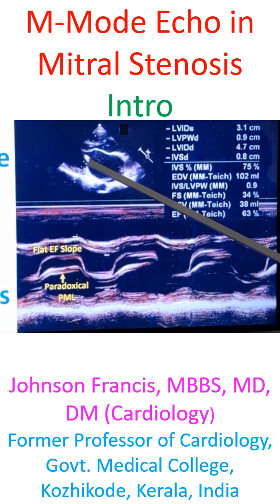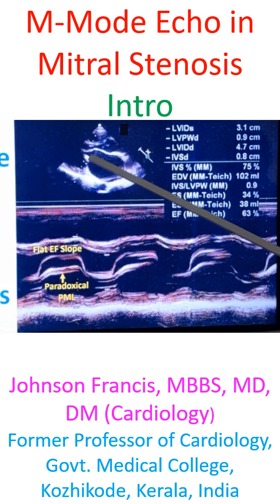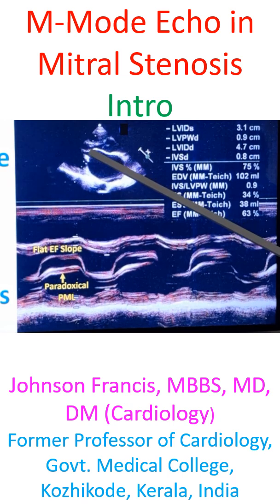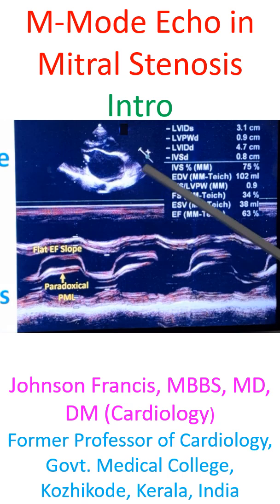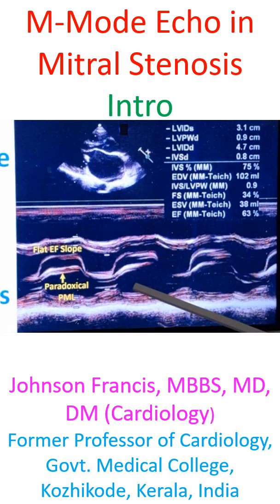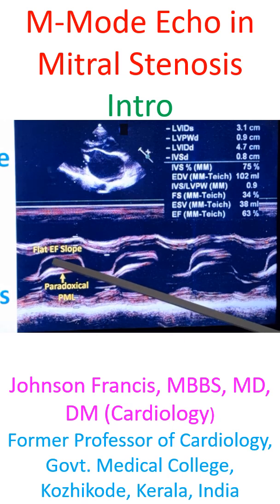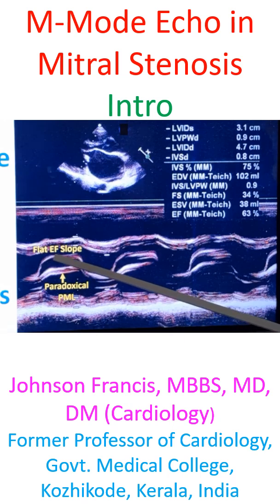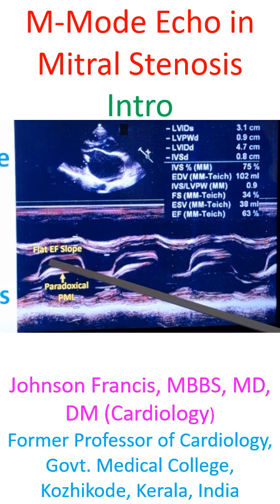There is calcification of the posterior mitral leaflet, which is moving paradoxically, and the anterior leaflet of the mitral valve is doming. These same features you are seeing in echocardiogram, M-mode echocardiogram also. The doming — the corresponding feature is this anterior motion of the mitral leaflet.